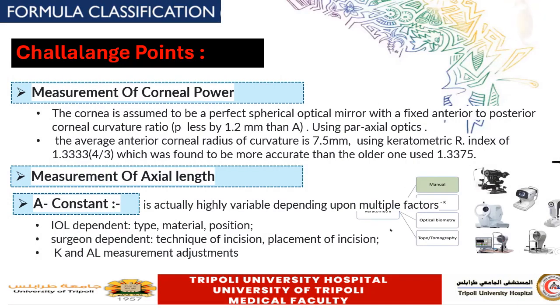Among the challenging points that face doctors in having a universal IOL formula that can deal with all types of eye as far as the anatomy is concerned, dealing with short eyes, long eyes, and average sized eyes, and also dealing with the different situations of the cornea, ranging from virgin cornea to a cornea that has undergone refractive surgery.